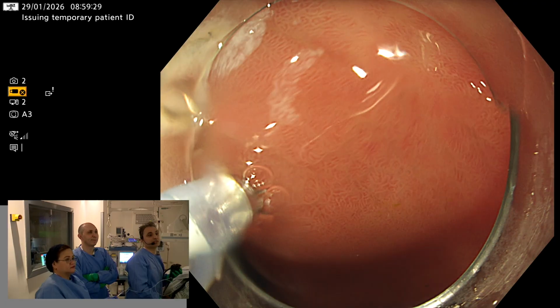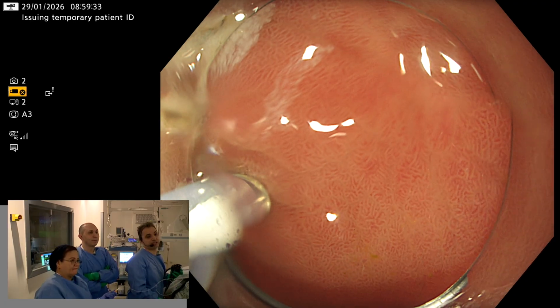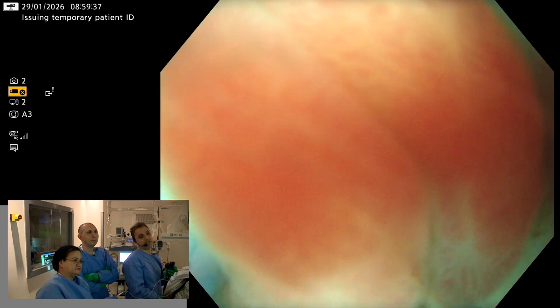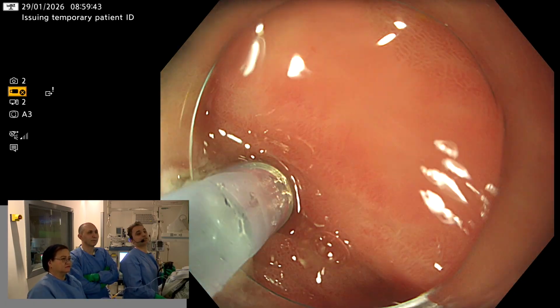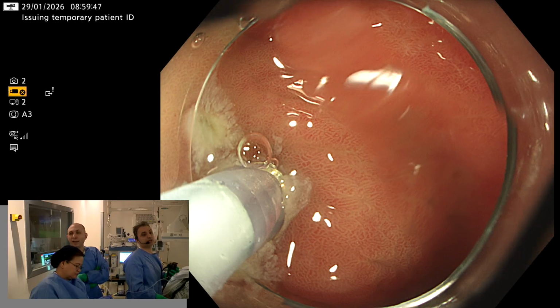Needle out. You see, I am fixing the length of my needle injector, and I ask my assistant to inject. So inject, and I'm pressing, okay, needle in. I don't change the length of the needle injector. Needle out. Injection, little bit. Okay, needle in.